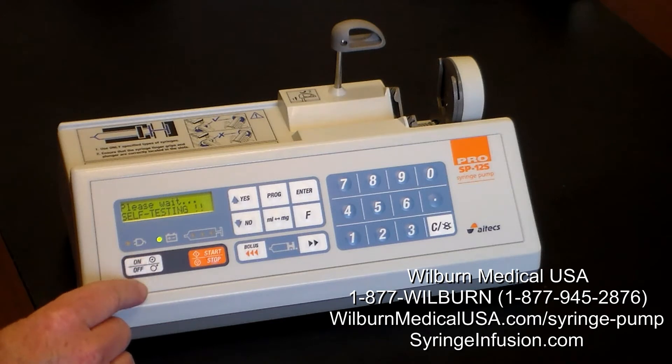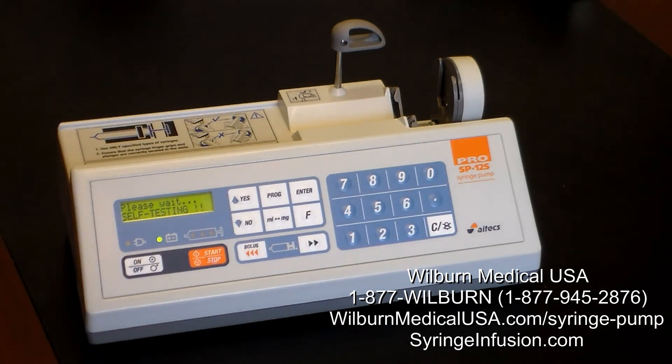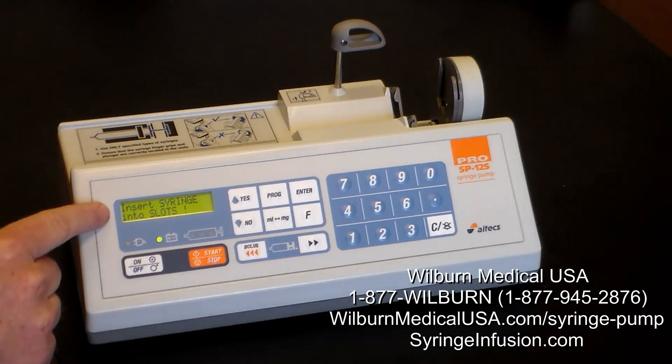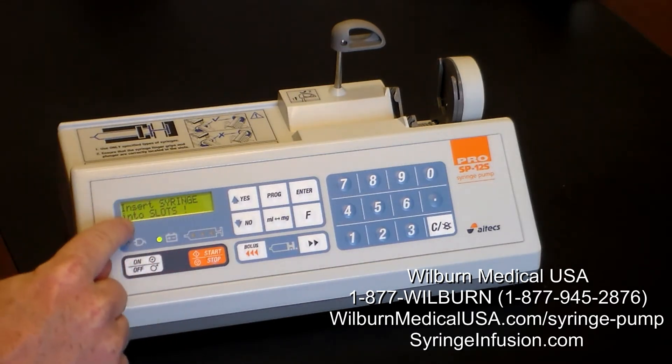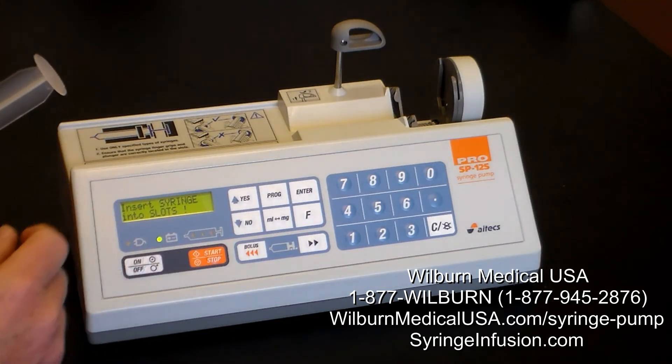We turn the device on with the on-off switch. It goes through an internal check of the circuitry. It reminds us of the continuous rate mode, and now asks us to insert the syringe into the slots. It will prompt us through by reading the screen on exactly what step is required next.